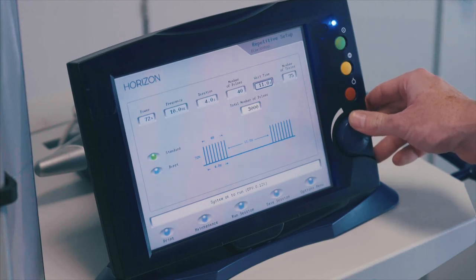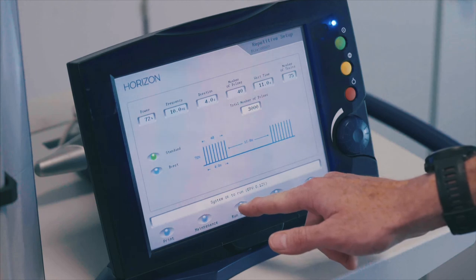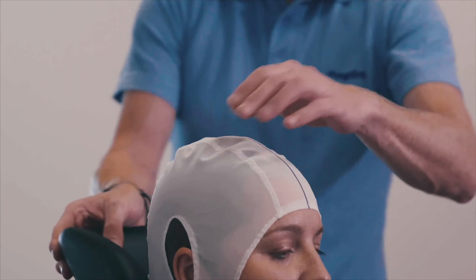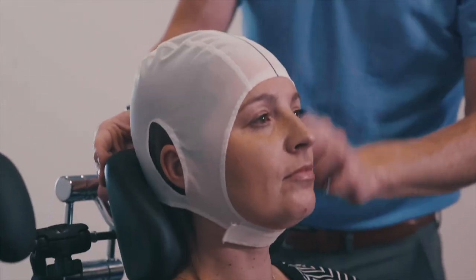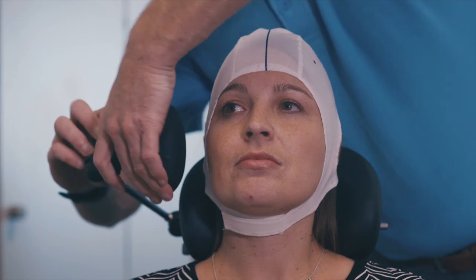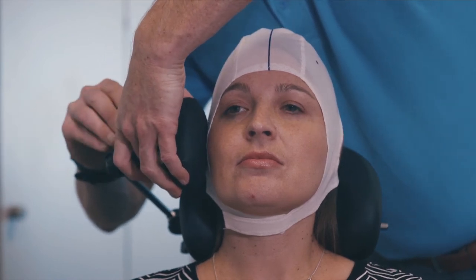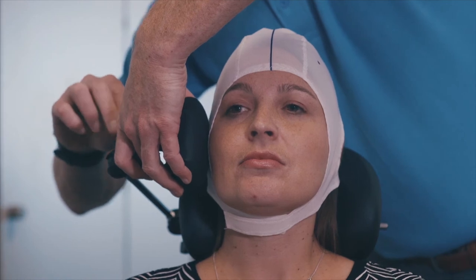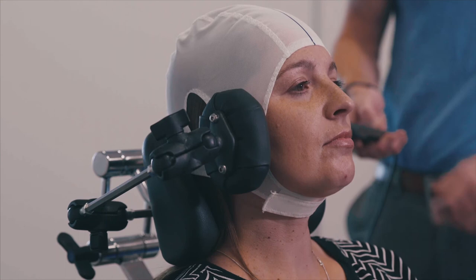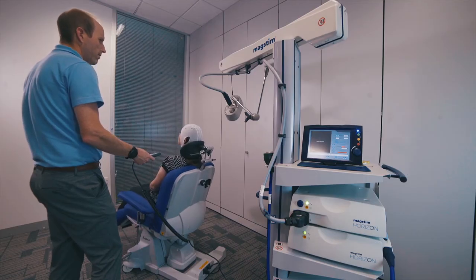Select the Run Session button to prepare for treatment. Adjust the chair headrest and ensure the patient's head is secure and comfortable. Adjust the head side pad so that it rests against the side of the patient's head. Using the remote control, recline the chair so that the patient is comfortable and reclined.